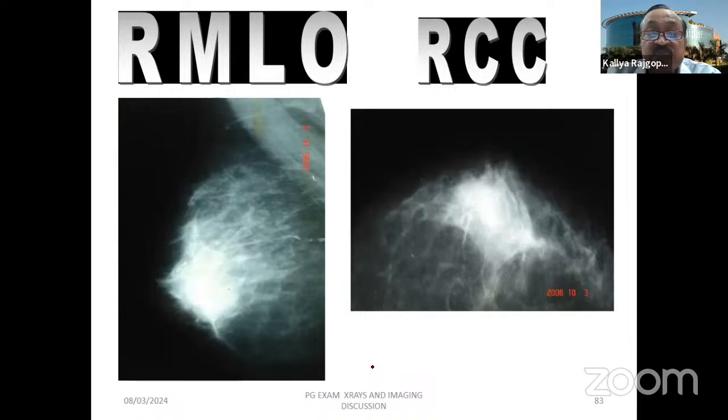Yes, of course, it's a painful procedure. The breast is compressed, so right or left mediolateral oblique and craniocaudal, two views. You can see here, that's the arm there. So there's the upper one. And these are actually vascular markings. This is only to show you the images: superior, inferior, medial, and lateral. So this is how you diagnose. This is actually a normal.